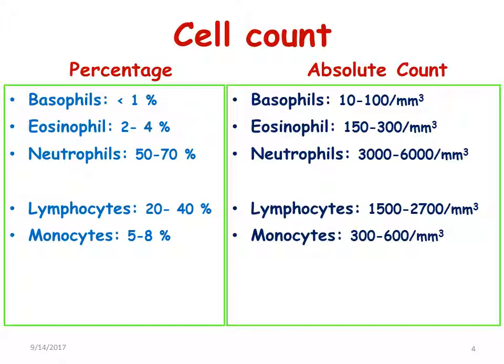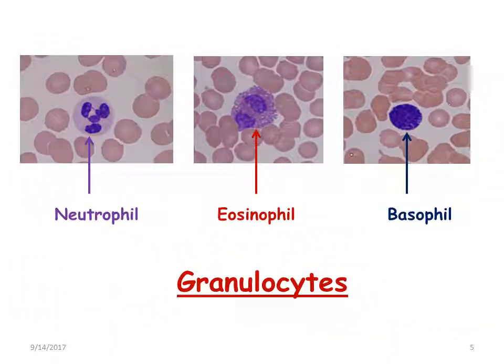Looking at how these cells appear: the first cell you see is a neutrophil, almost double the size of the surrounding RBCs, with a lobed nucleus. Next are the eosinophils — also surrounded by red blood cells — with a bi-lobed nucleus and coarse granules taking up a reddish-pink color. The basophil contains a nucleus that is masked by its granules because they pick up the same bluish-black color of stain.